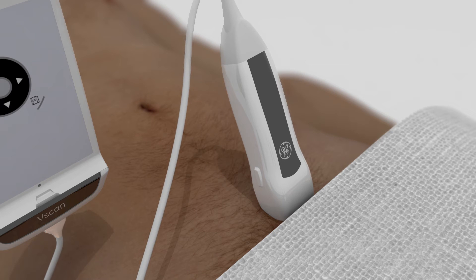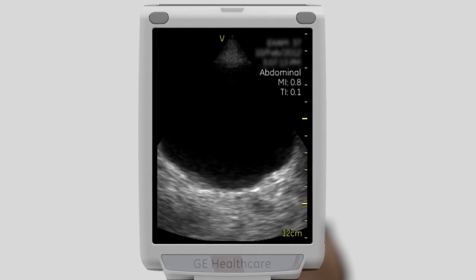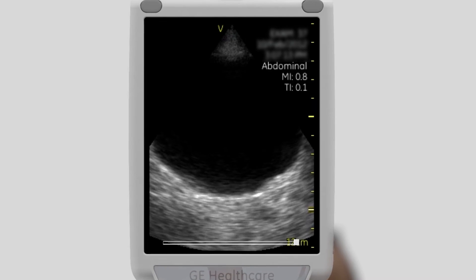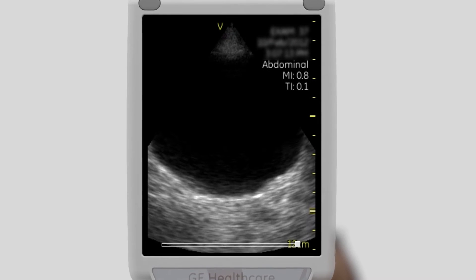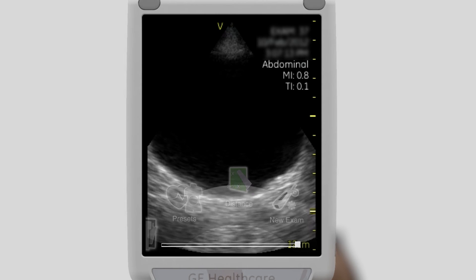In the transverse view, scan the bladder from the proximal to distal end. Obtain a mid-transverse image where the width of the bladder appears to be at a maximum. Adjust the gain and depth to obtain a diagnostic image. Measure and document the transverse dimension.